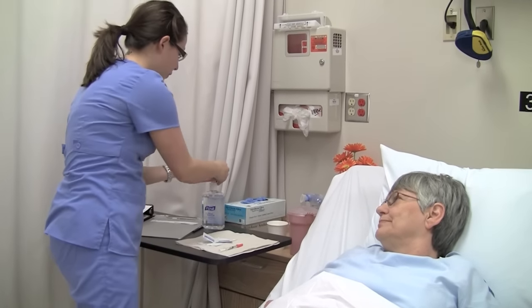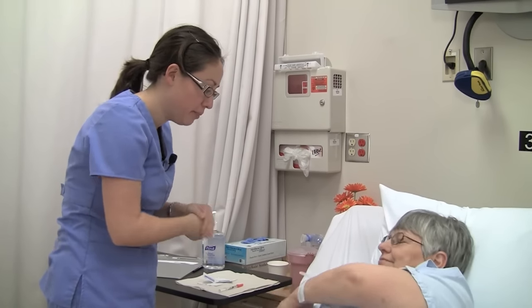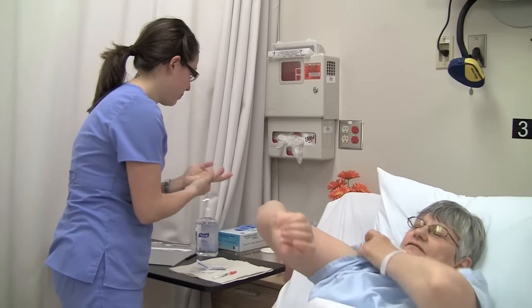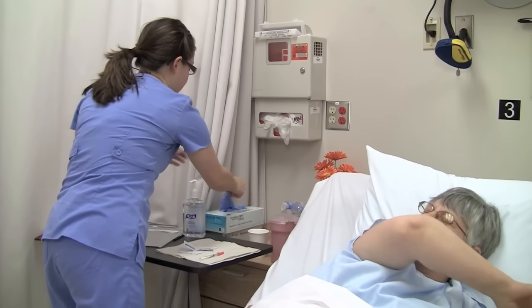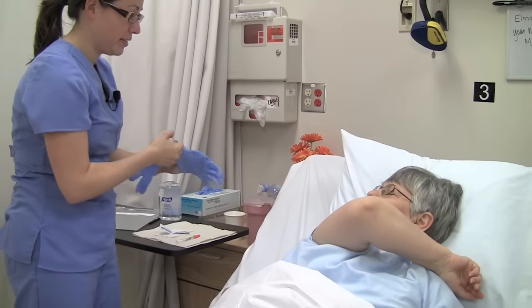Wash your hands. I'm going to wash up my hands and I'm going to need to have access to your arm here, so I'd like you to raise your arm up. Is this the way you want me? That's great, Alma. Thank you so much.